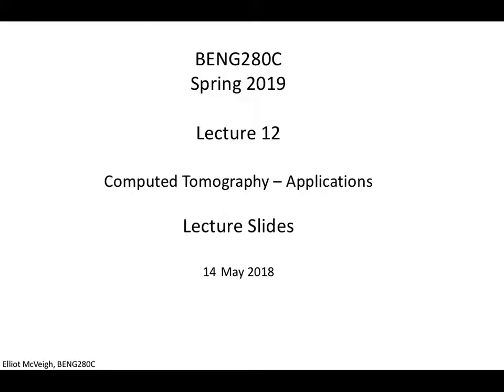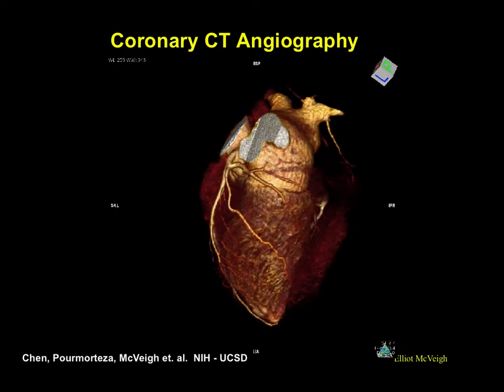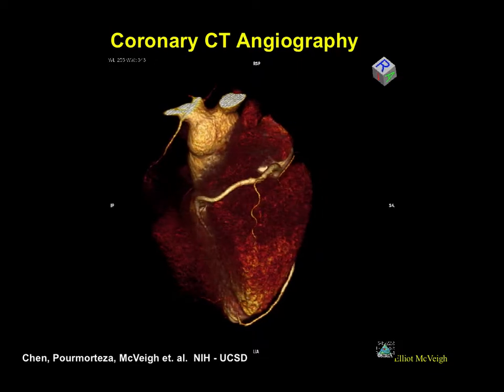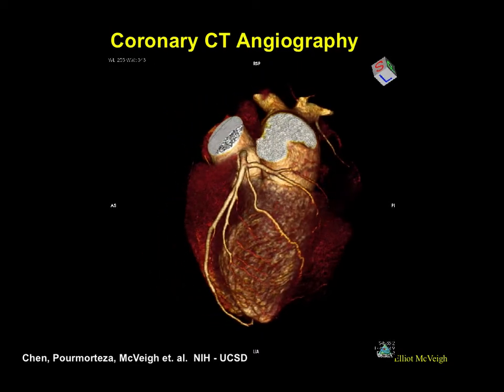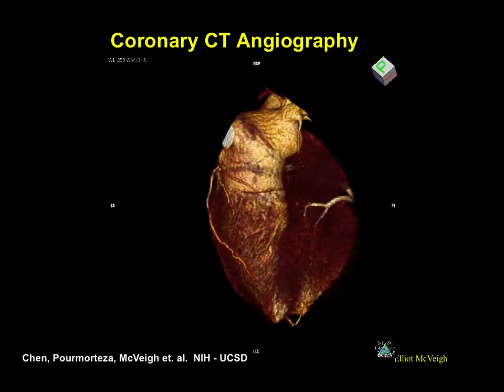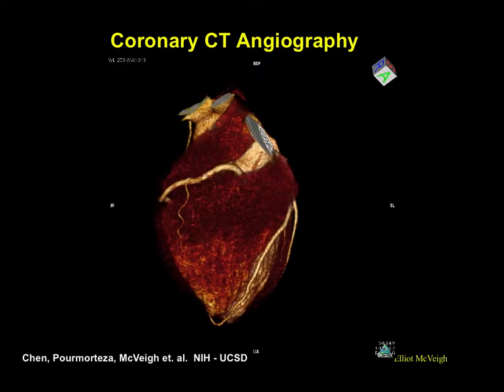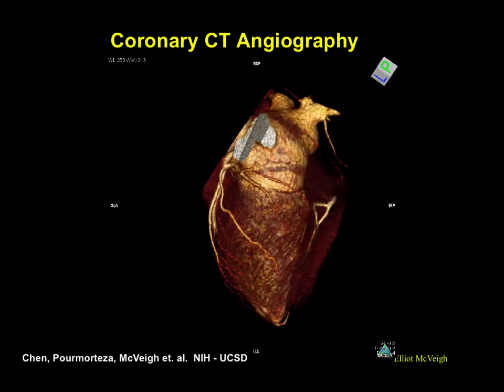Basically, it took too long to do that, and it took too much dose. And so now we're at a situation where we can make these pictures like this in 150 milliseconds. And so you've got a volume in 150 milliseconds, and that became possible about 5 years ago, maybe 10 years ago in some places, but widely available for sale in the marketplace 5 years ago.